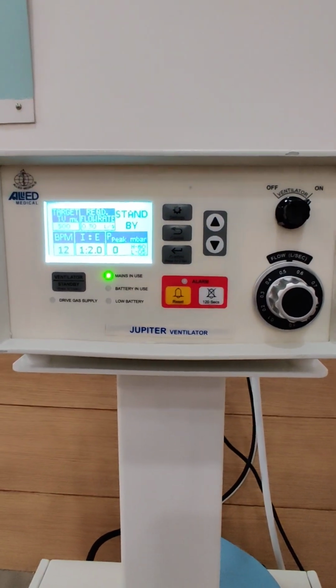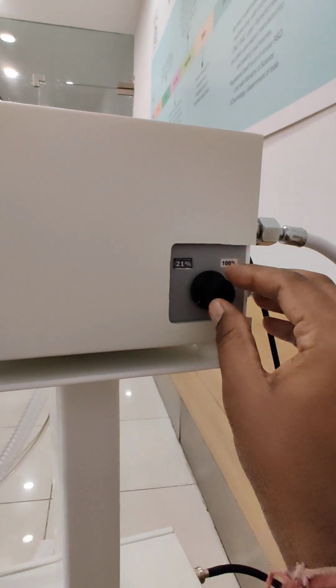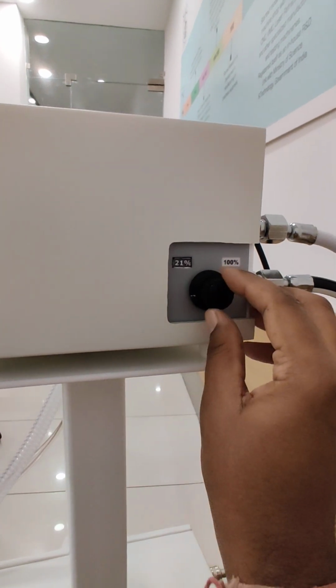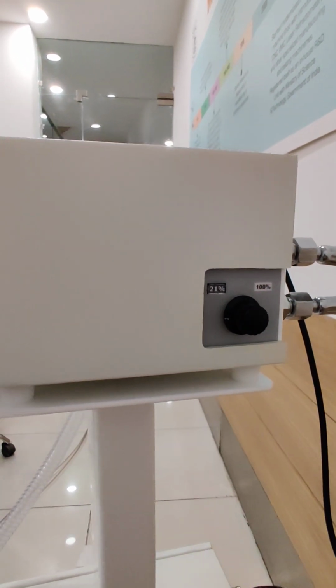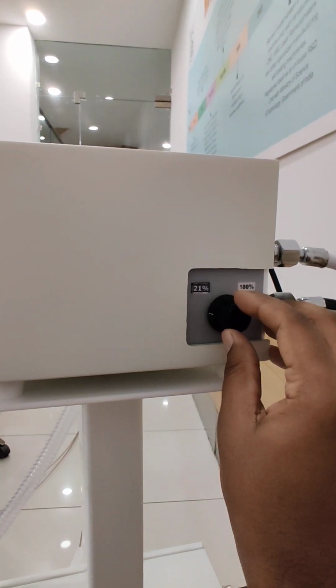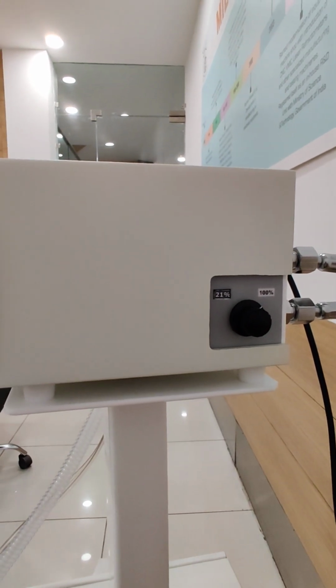As it was mentioned earlier also, it has a built-in blender, so you can run this ventilator between 21% to 100%. So this is the O2 concentration knob over here. If you want to give between 21% to 100% oxygen to the patient, the FiO2 value can be increased or decreased with the help of this knob, and the oxygen enrichment can be done.